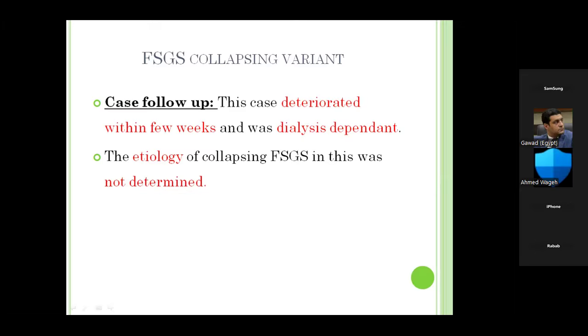Can we see it in the biopsy? That's what I was talking about. It will not. It is not a collapsing FSGS. A collapsing FSGS usually presents with heavy proteinuria. There could be some cases with a segmental lesion; it's not a collapse, it's just an obliteration of the glomerular capillaries without florid hyperplasia of the overlying podocytes and the resorption droplets.